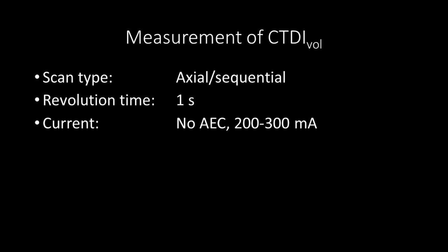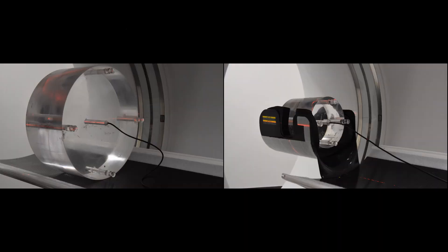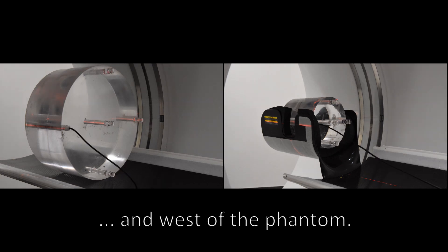To measure the volume CTDI, use the following parameters: Sequential or axial scan type, tube revolution time of 1 second, manual current around 2 or 300 milliamp, tube voltage of 120 kilovolt. Irradiate during 1 single revolution per chamber position and report the primary beam collimation at isocenter. Measure the dose with chamber in the center, north, east, south and west of the phantom.